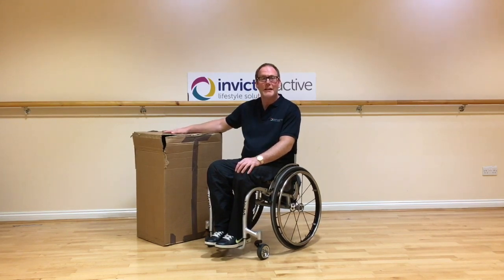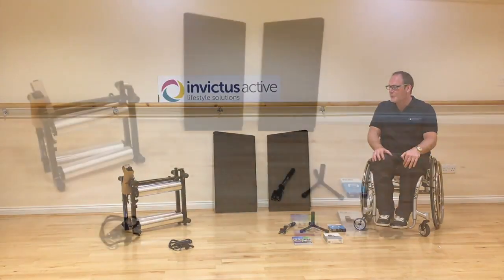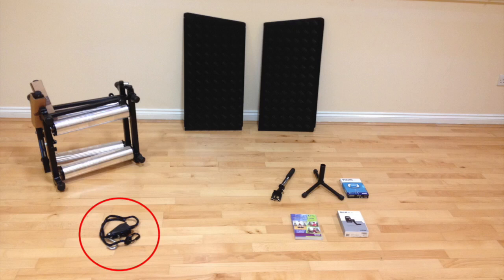You've taken delivery of your Invictus Active Trainer. Let's open the box and see what's inside. Having unpacked the box, you should find the following items: the trainer, a pair of ramps, and a ratchet strap.